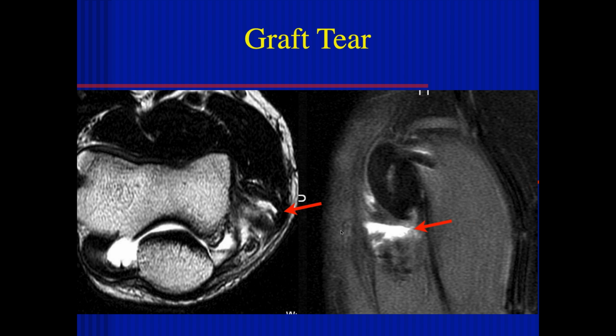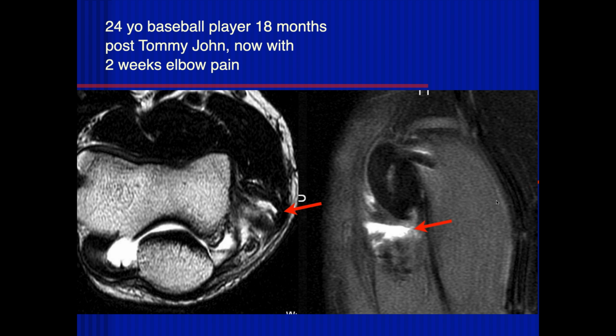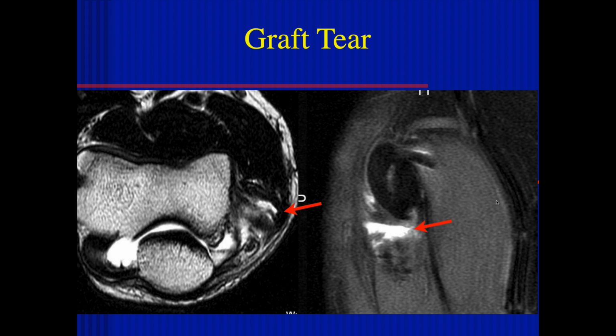Yeah, so this is a graft tear. And you notice not only is there a tear here, but it's markedly thickened. So there's a lot of wear and tear and degenerative disease in that graft, which probably predisposed to the graft tear. These can be redone. There are a large number of Major League Baseball players who have had multiple Tommy John procedures, but it becomes obviously much more complex and difficult when you have to go in a second or third time.